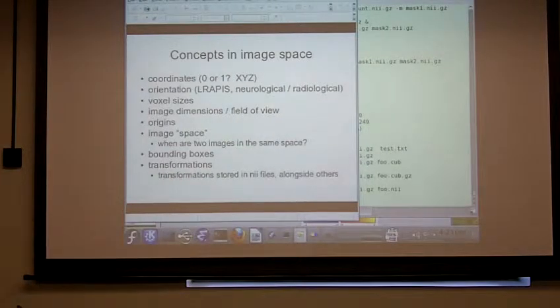So, as a practical matter, what this means is that what you see in the files isn't always what's really in there, or vice versa, depending on which way you have the flag set in your image viewer. And furthermore, sometimes you'll have data stored alongside the image file that's actually very important in representing spatial transformations that may have been calculated for that image. Typically, if you're doing an fMRI study, this is required for things like realignment of volumes and for co-registration of functional and structural data. But it's also potentially useful in lesion analysis for co-registering different modalities that may have been acquired.